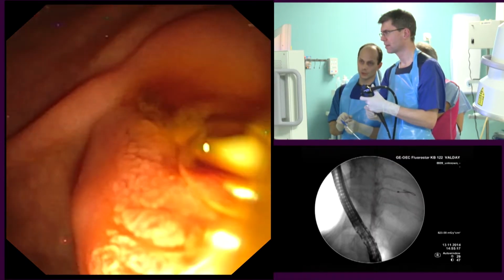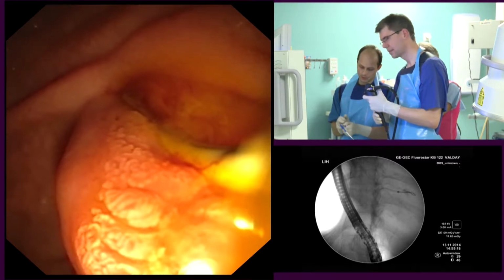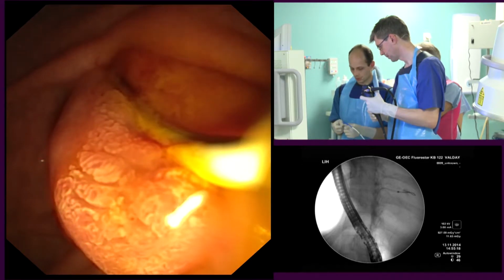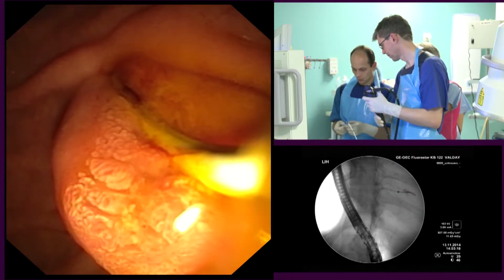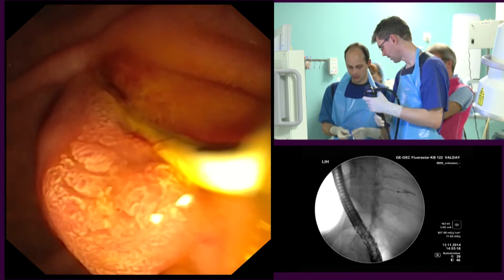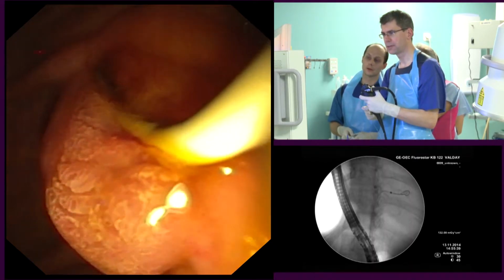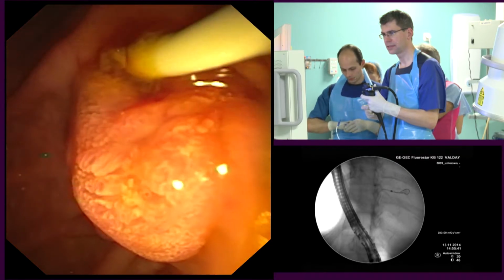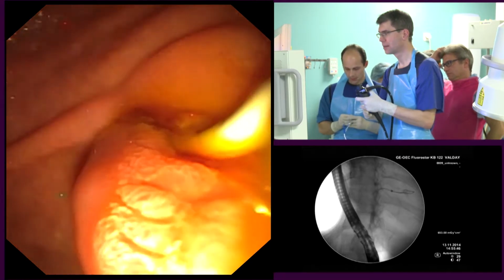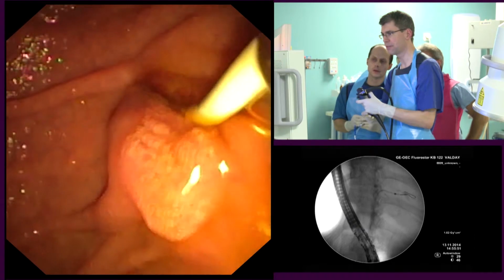I'll try one more time, because I just feel very bad resistance here. And we use a gas, so it's not a liquid. Close it. No, I'm afraid this balloon is not anchoring the way we like. I can still move it quite freely, so this will mean that the balloon is not inflated.